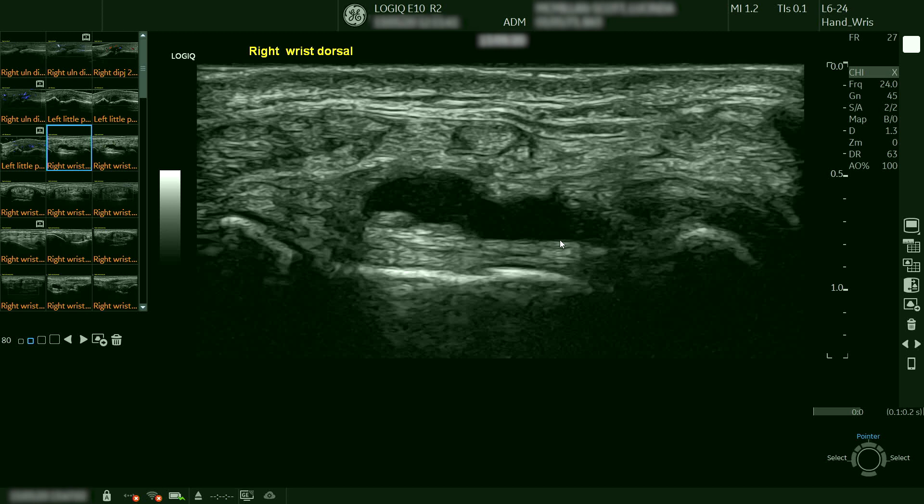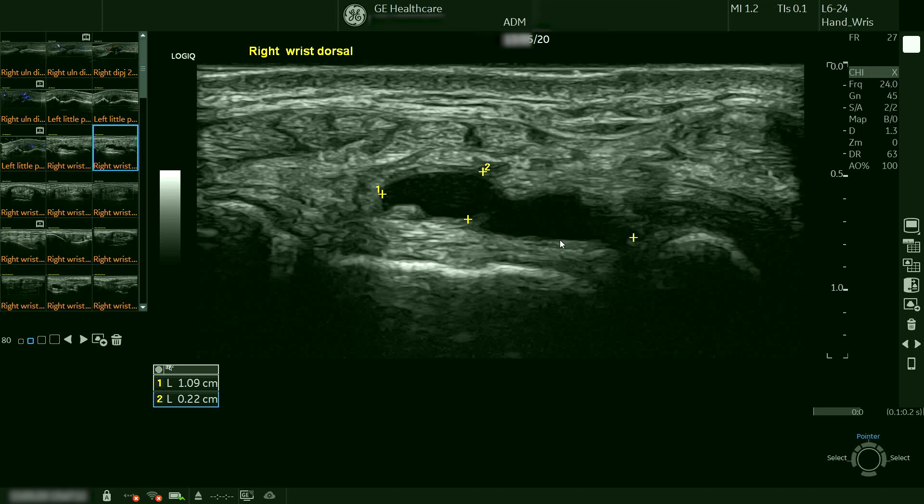The swelling on the dorsum of the right wrist turned out not to be synovitis but a ganglion, which is well shown here, and we've measured to outline it.